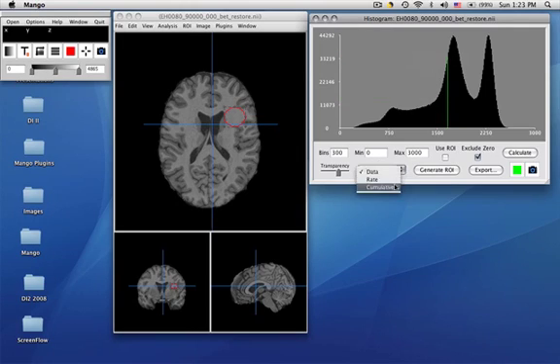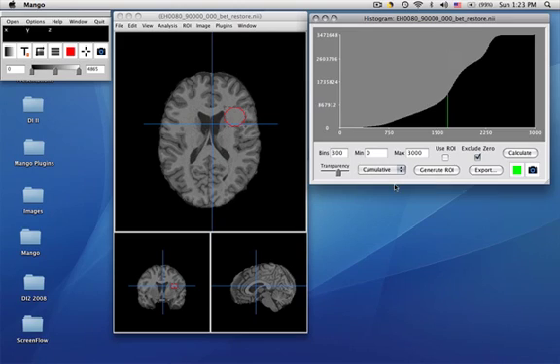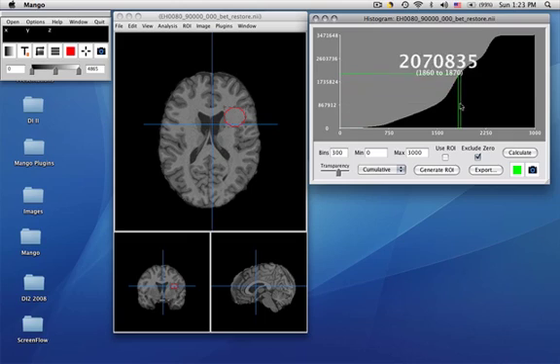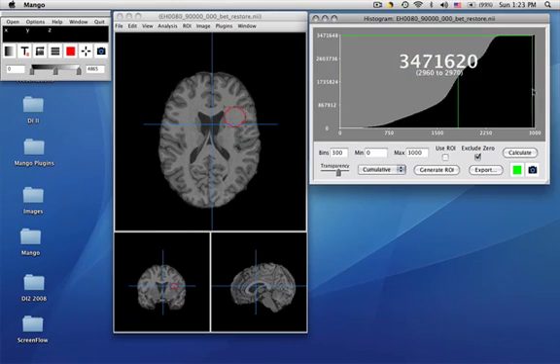Another nice feature is the cumulative values in the histogram. So wherever you click, you get the total number of voxels between the beginning range and the range you have. So this is voxels between, in this particular case, zero. And this bin range of 1820 and 1830, there's quite a few voxels you can see. And then this is all of the voxels in that range.